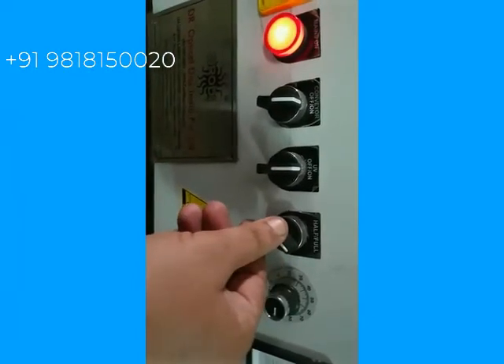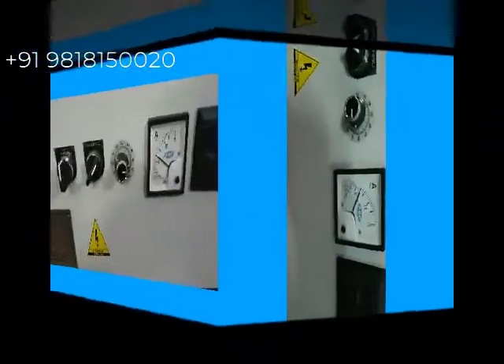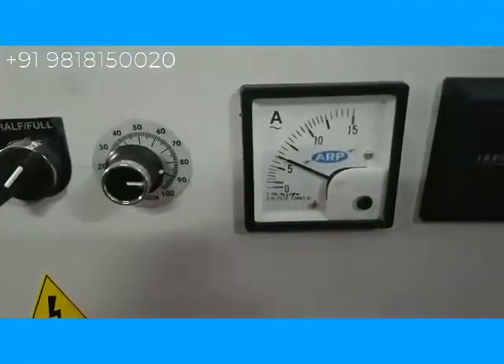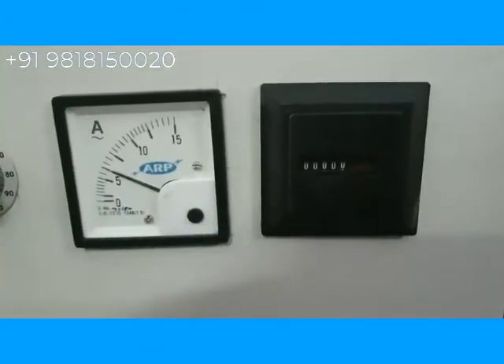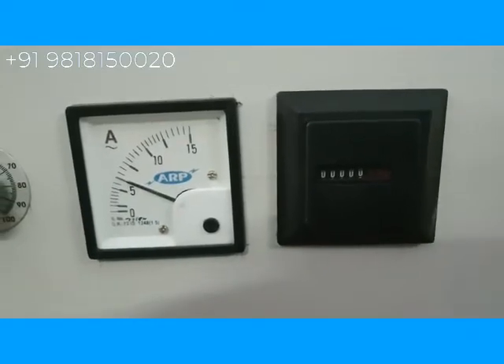The fourth control is for half and full intensity of the lamp — you can keep it at half or you can keep it at full. This is the ampere meter, which shows the current of the lamp. And this is the hour meter, from where you can see the life of the lamp.